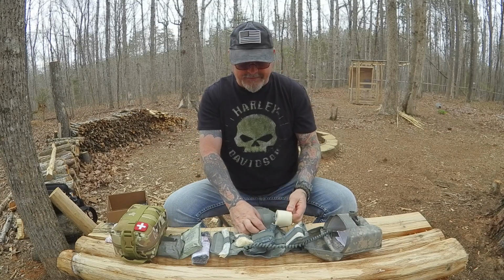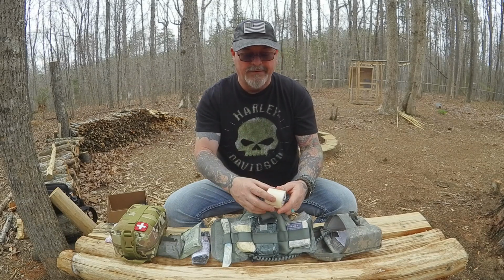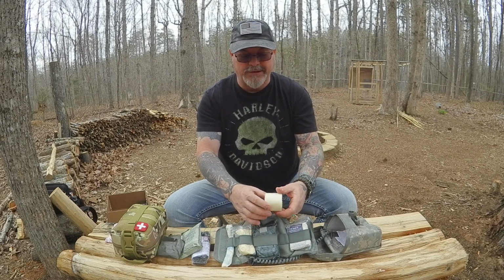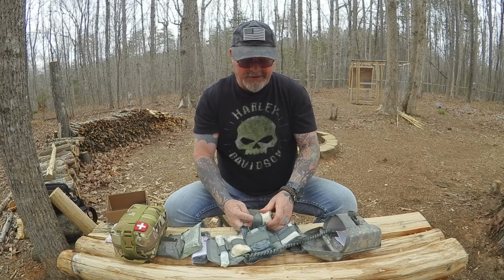You've got some ace bandage wrap. This is tape, excuse me, not ace bandage wrap, but tape. They have it on a hook roll so you don't lose it, so it doesn't disappear, and you can peel it off and use it. So that's your tape. We're gonna tuck that back in there.